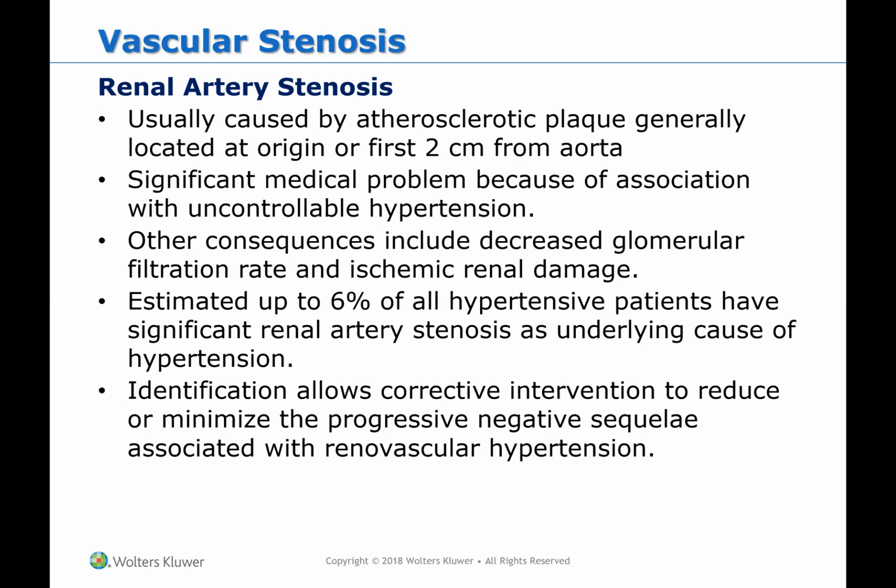Now, sometimes you'll get so lucky and you'll get that patient and you can just see both branches coming off of the aorta and it's just gorgeous. And you can Doppler at every single section that you need to. And it's wonderful, and you feel like you got a good study. But a lot of the times, these renal artery studies are limited. And I don't know how many times I put limited study due to body habitus, or bowel gas. But you still try to do your best.